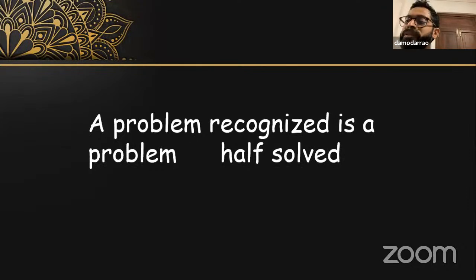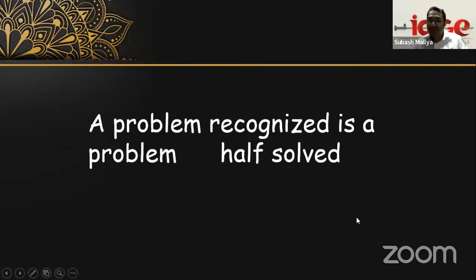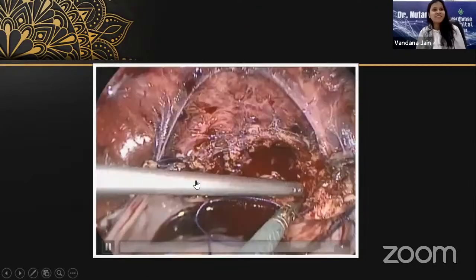Monopolar we use now only for PCO puncture, nothing else. Sorry, monopolar is now used only for PCO puncture. That is a bladder dissection also. Colpotomy also, a lot of people are using monopolar. That is a debate for another day, Damu. Use of monopolar, I think you probably recognize the problem. They're using it for myomectomies also.